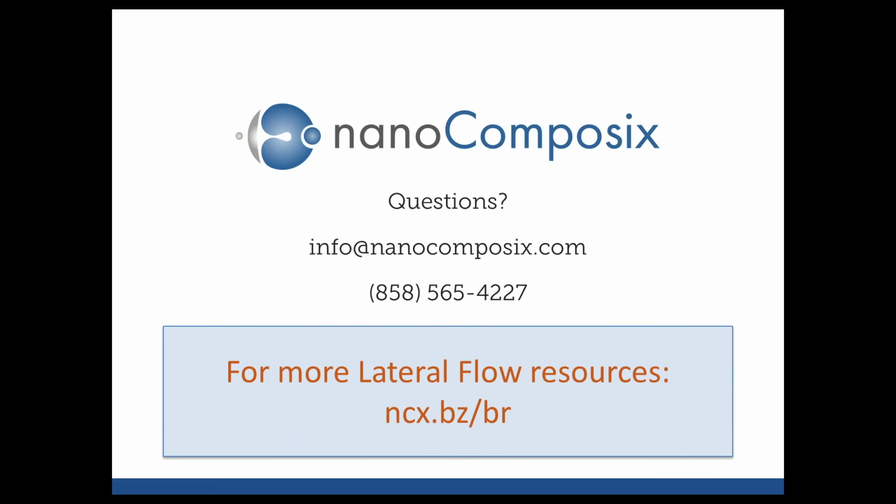Okay, next question comes from Keith. He asked, what type of conjugation do you recommend for a sandwich assay? That's really antibody dependent. We typically start by performing covalent conjugations, and if the end result doesn't look as promising as we think it should, sometimes we'll go back and try passive conjugation methods or select a different antibody to use.